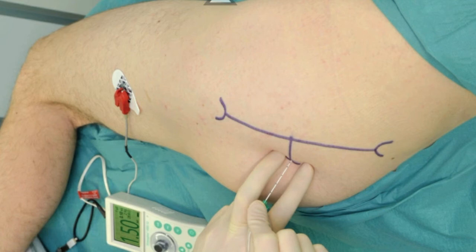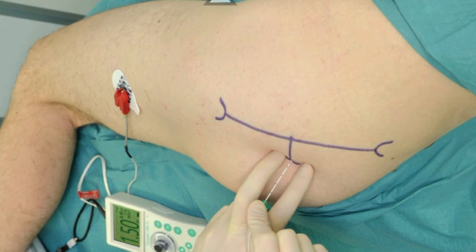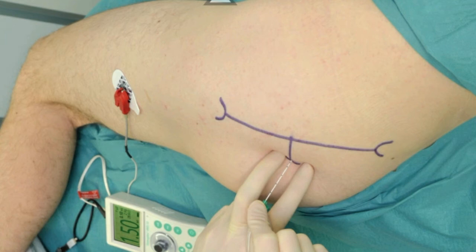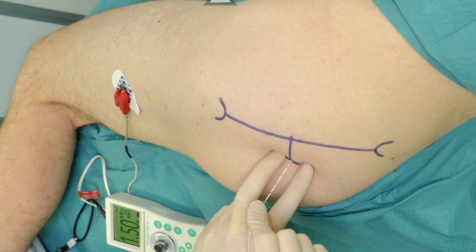In order to perform this block, the patient is placed in the lateral decubitus position with a slight forward tilt. This prevents the sag of the soft tissues in the gluteal area and significantly facilitates block placement. The foot on the side to be blocked should be positioned over the dependent leg so that twitches of the foot or toes can be easily noted.